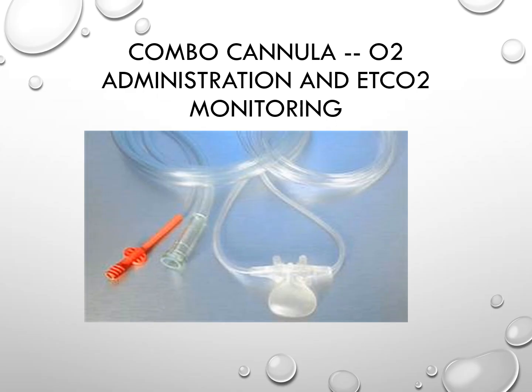Now you see a spoon-shaped, whitish element to the nasal cannula on the lower right-hand side. That would actually go over the mouth. So do also understand that if the patient is primarily a nose breather or is breathing with their mouth closed, that is something else that could distort the result as well.